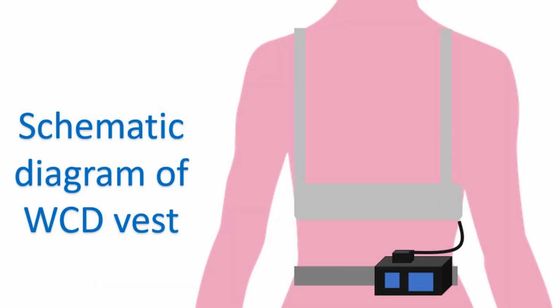The device is usually implanted below the left collarbone and its electrical leads are introduced into the heart through the nearby blood vessel known as the subclavian vein. There is also a variety of ICD known as the purely subcutaneous ICD, which does not have a lead inside the heart. The lead of the subcutaneous ICD is implanted under the skin of the chest itself. Yet another variety is the wearable cardioverter defibrillator or WCD. Both these have been covered in detail in other videos on this channel.